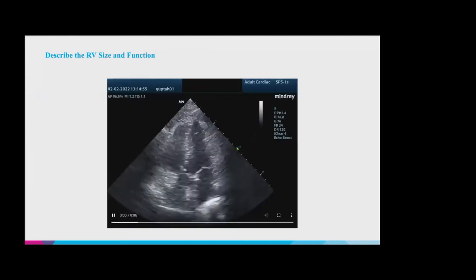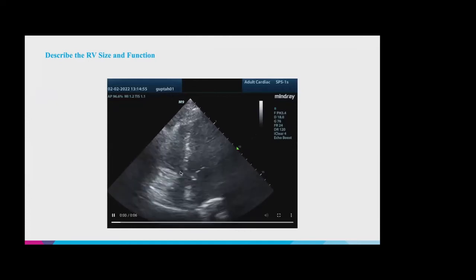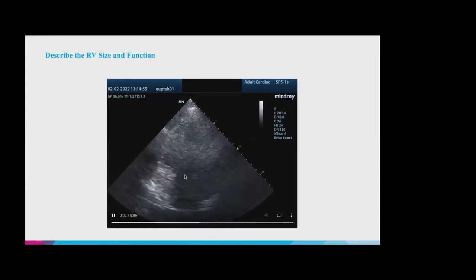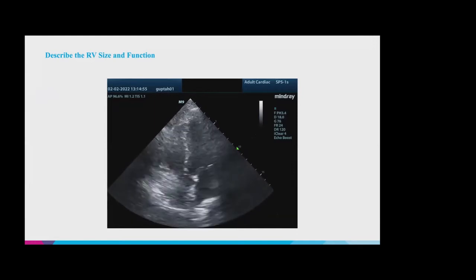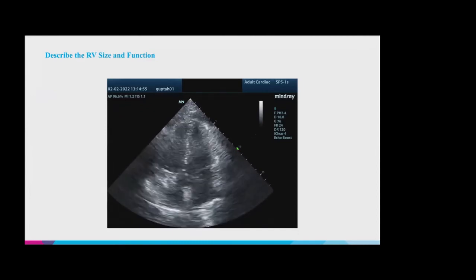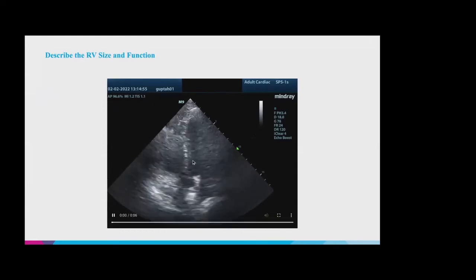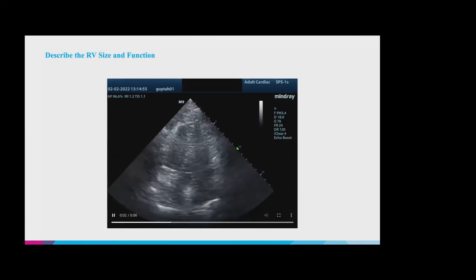And then this is the same patient looking at the apical, or it's actually an apical 5 chamber, right? Because you can see the aortic valve and the aortic outflow tract coming in as well. What do you guys think? There, it looks like the right ventricle may be a little bit dilated because it's almost the size of the left ventricle instead of being less than 2/3. You can see the aorta, so it's the 5 chamber, but it might be upper limits of normal or just mildly dilated. Yeah, I would probably call this mild and maybe even moderate. It's almost equal in size, I agree.